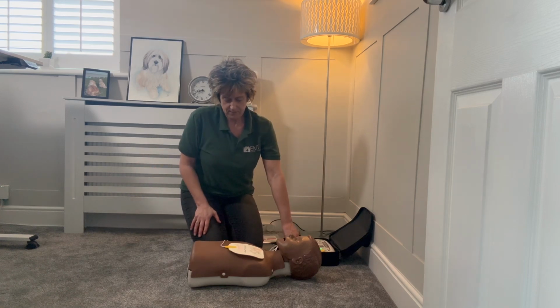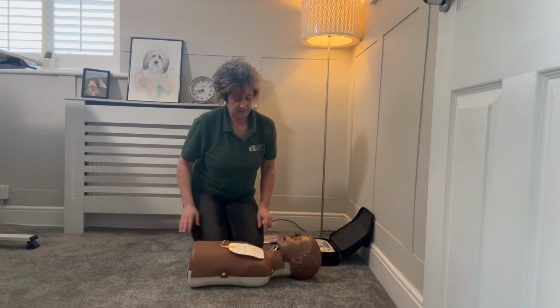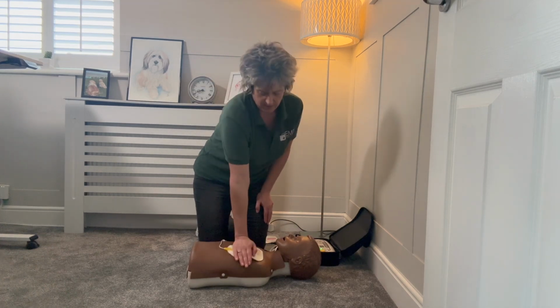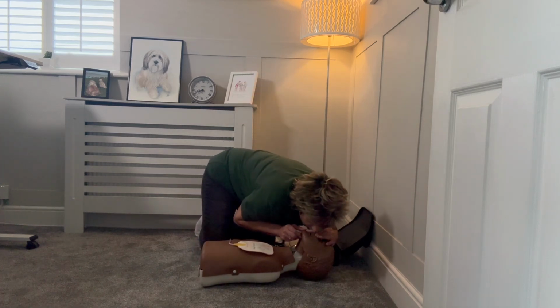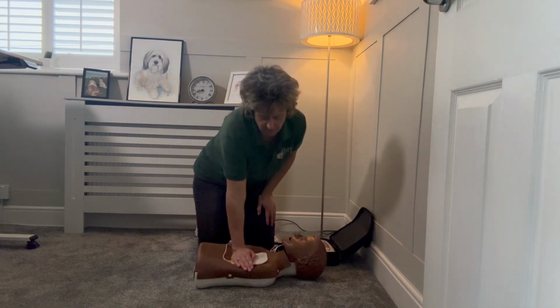Analysing heart rhythm. Shock advised. Stand clear. Press shock delivered. Begin CPR now. Press the flashing blue I button for CPR voice prompt. Reanalysing heart rhythm in 2 minutes.